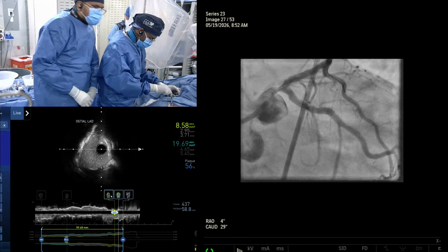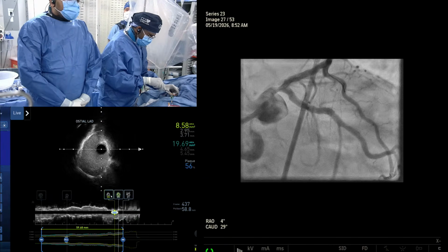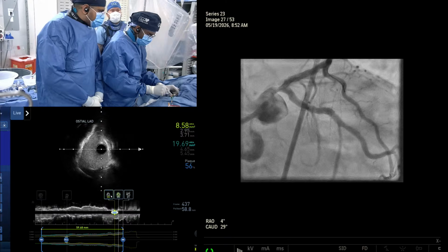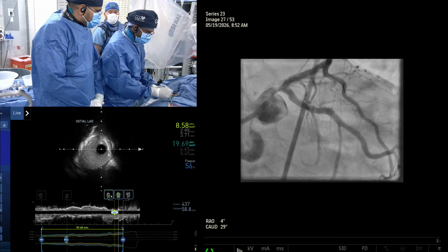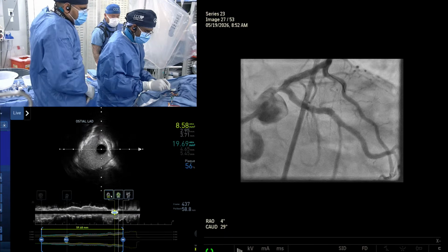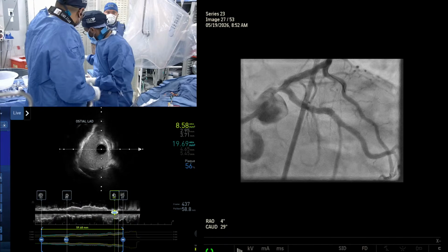But most of the time, micro OCT or pathology studies have shown that once you've done IVL, you always see some kind of even microfracture in this calcium. But it looks like despite us doing 4 pulses in the ostium, Kiski, show it to them, the stent expansion is not optimal.